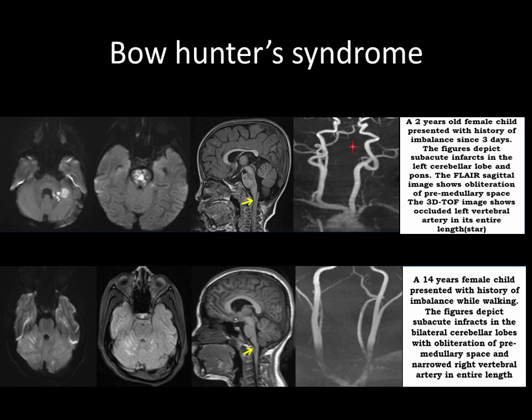Another case of a 14-year-old female child who presented with a history of imbalance while walking. These figures depict subacute infarcts in bilateral cerebellar lobes with obliteration of premedullary space and a narrowed right vertebral artery in its entire length, depicted in the 3D TOF image.